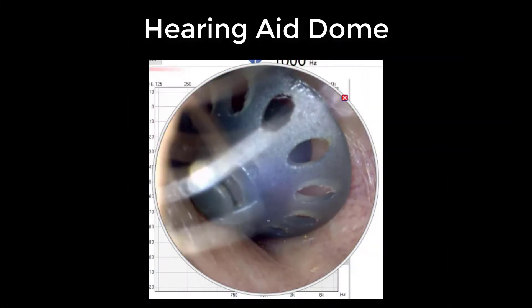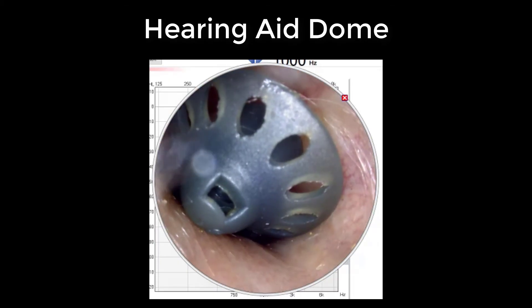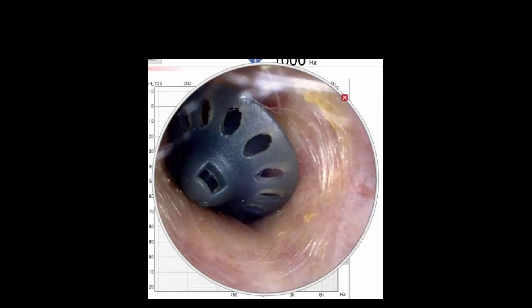Now we have an example of a foreign object stuck inside of someone's ear canal. Every once in a while, a patient will come in wondering why their hearing aids are not fitting inside of their ears as well as usual. In some cases this is ear wax buildup, and in other cases a hearing aid dome pops off inside of their ear canal. While this may seem like an emergency, hearing aid domes are typically easy to remove without complication.